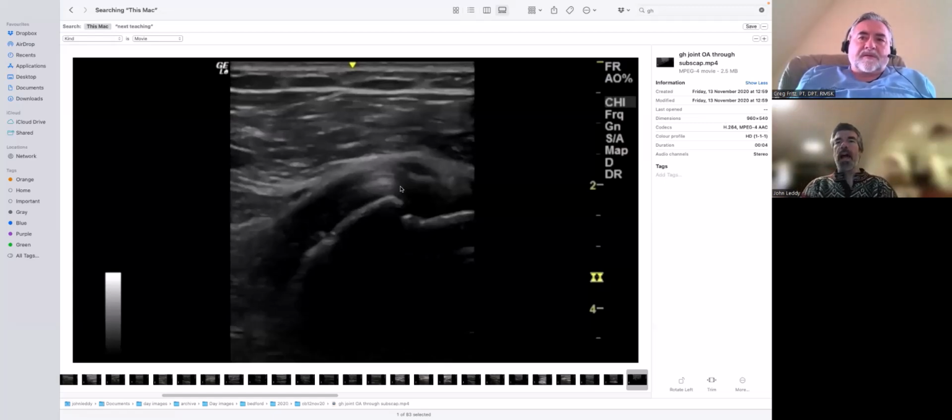But I think X-ray will see that before you see it on ultrasound, when they're lucky enough to get the right slice. But in terms of picking up glenohumeral joint arthritis, ultrasound certainly appears to be much higher sensitivity than a plain film. And I think these are cases you can argue backwards and forwards: when we see subtle tears and tendinosis in the rotator cuff, whether doing the scan does the patient any significant good as opposed to just the placebo effect.